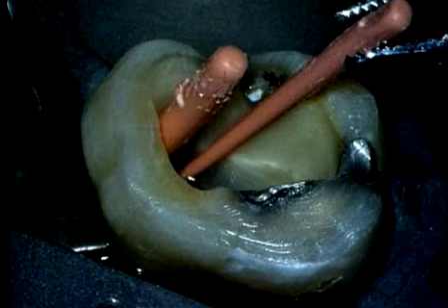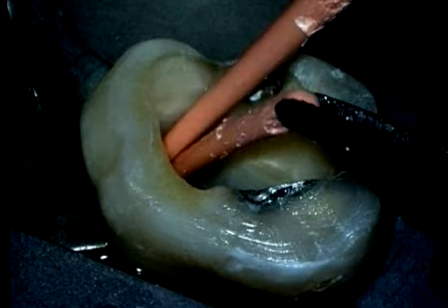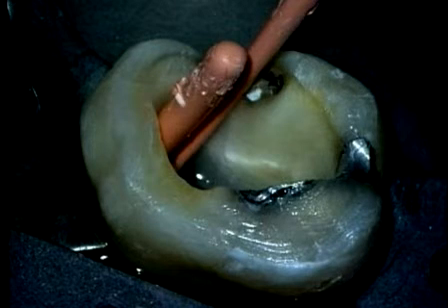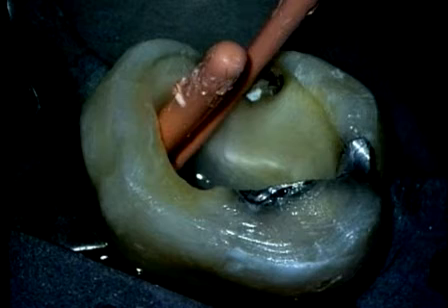Notice that this cone will not go to length. This suggests the canals merge and are common in their apical 1/3. To demonstrate this, we lift the MB1 cone out, and now this allows the MB2 master cone to be fully seated. This definitively demonstrates that the canals converge in their apical 1/3. The MB2 master cone is additionally trimmed to remove that portion of the gutta-percha that normally would have gone to length.